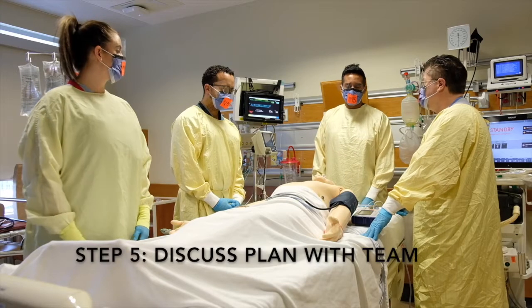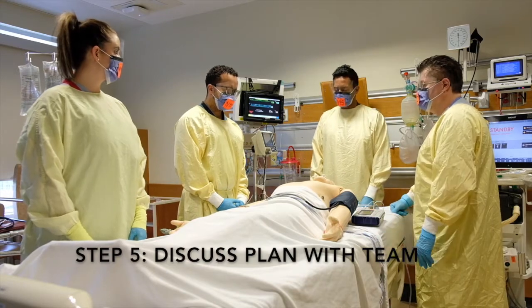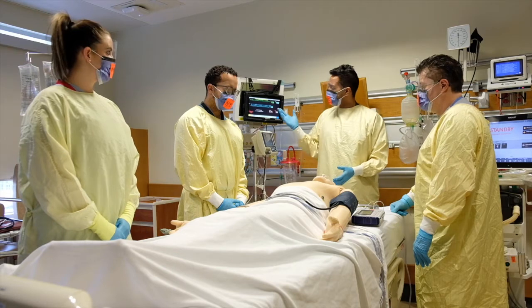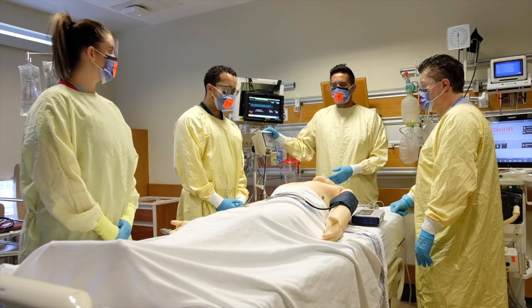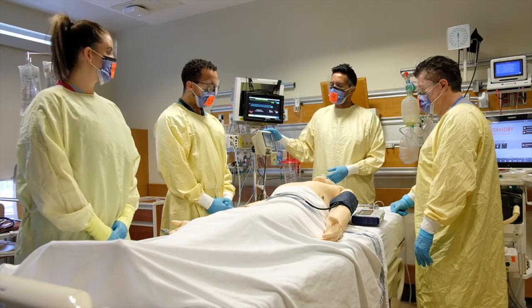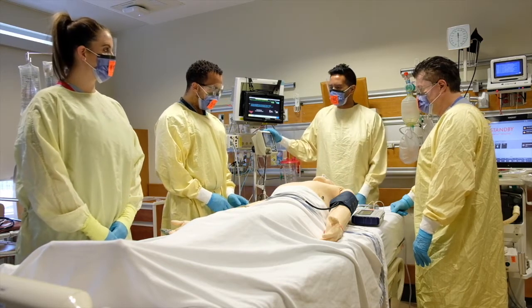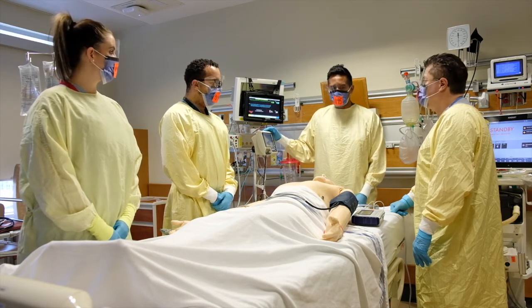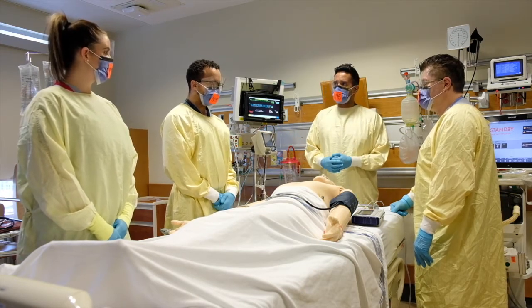So the last step in the checklist is to ensure that everyone on the team knows the plan. So we're going to be intubating this COVID-19 patient who has a low saturation. We'll be using glidescope as our primary technique for intubating with rapid sequence induction. If this fails, my plan is to go to direct laryngoscopy, and if that fails, we'll put an LMA in and try and get a more experienced operator in the room. Any questions, concerns, or is everyone ready to go?